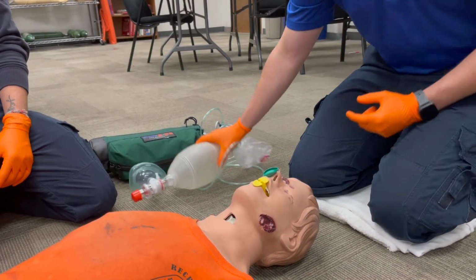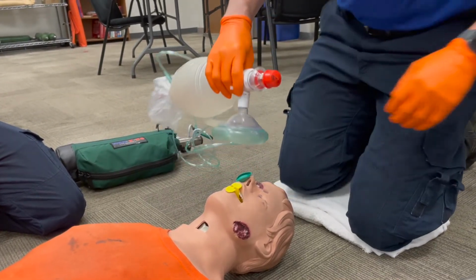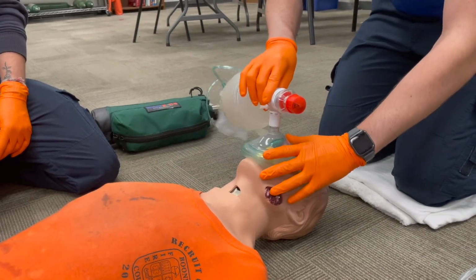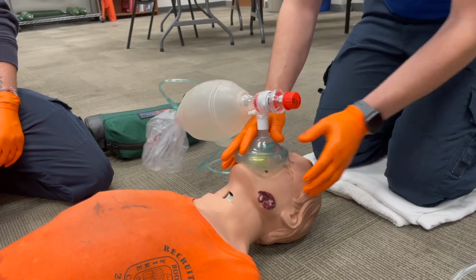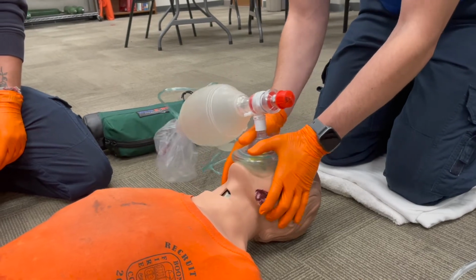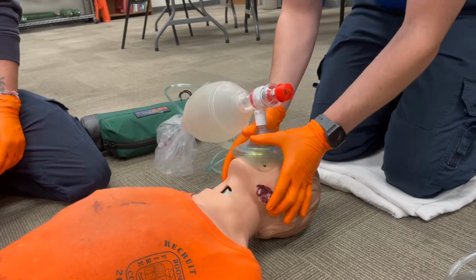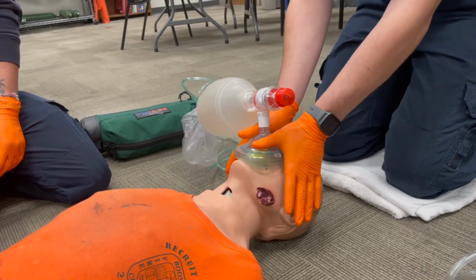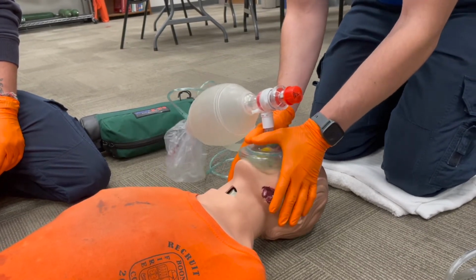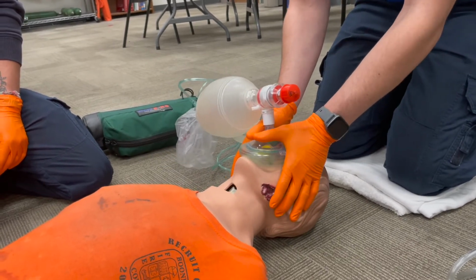Then when it comes to actually ventilating the patient, we're going to use the 2 thumbs down technique. That's really the only technique that you should ever use when manually ventilating a patient. So I'm going to put the mask over their face, and then I'm going to use my 2 thumbs to hold mask seal, and then I'm using my index and my middle fingers on both hands to perform a jaw thrust. What I'm not doing is I'm not pushing the mask down into the patient's face. I'm thrusting their jaw up into the mask. So I'm pulling their jaw up into the mask instead of pushing the mask down into their face.